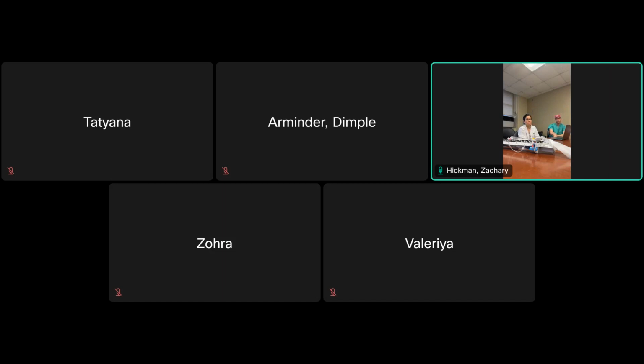The other time might be if somebody had a right-sided injury and you think this patient might end up needing a hemicraniectomy, but you're going to do an EVD first or maybe an ICP monitor, and you don't want to have to replace them. Then you might do it on the opposite side too. I do that with bolts as well. I try to not put it exactly at Kocher's so that we have room for an EVD if we need it. So all that kind of anticipation is important.